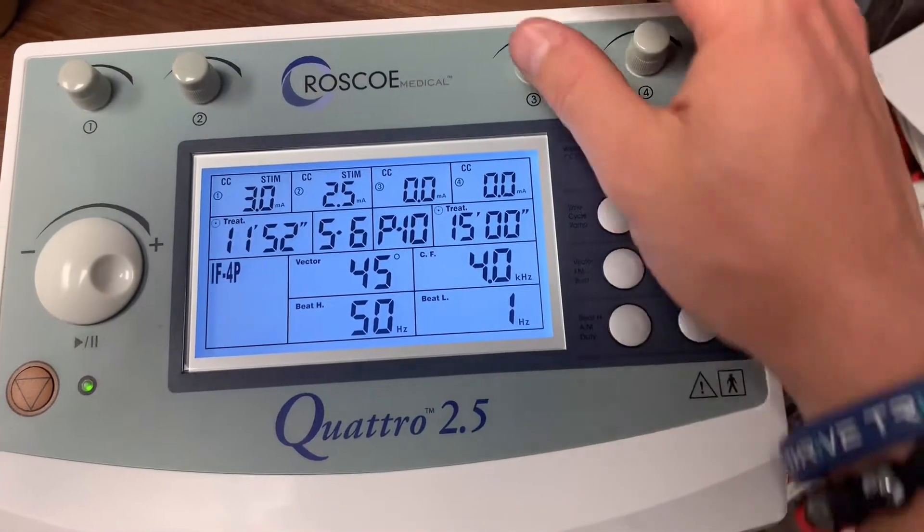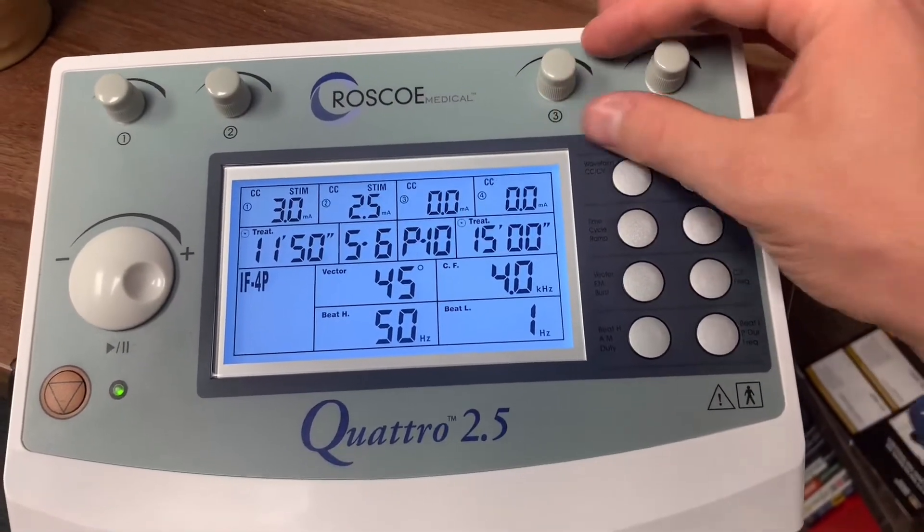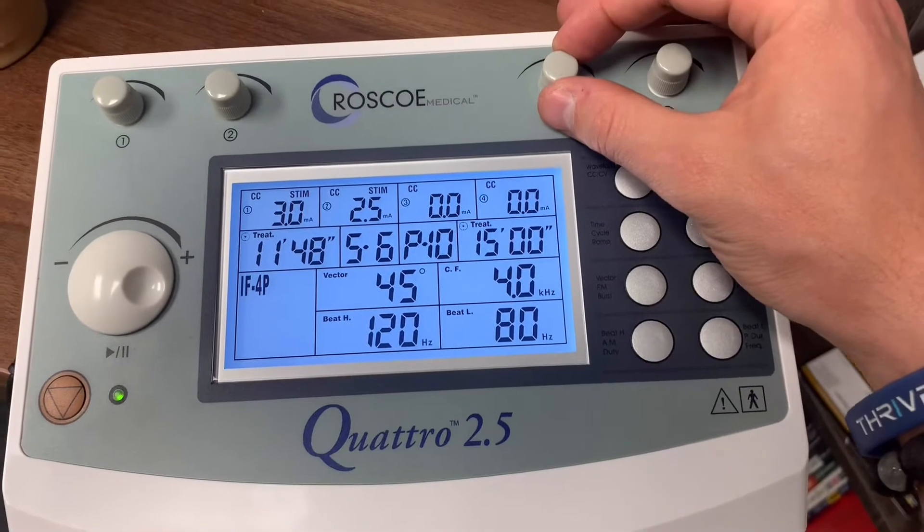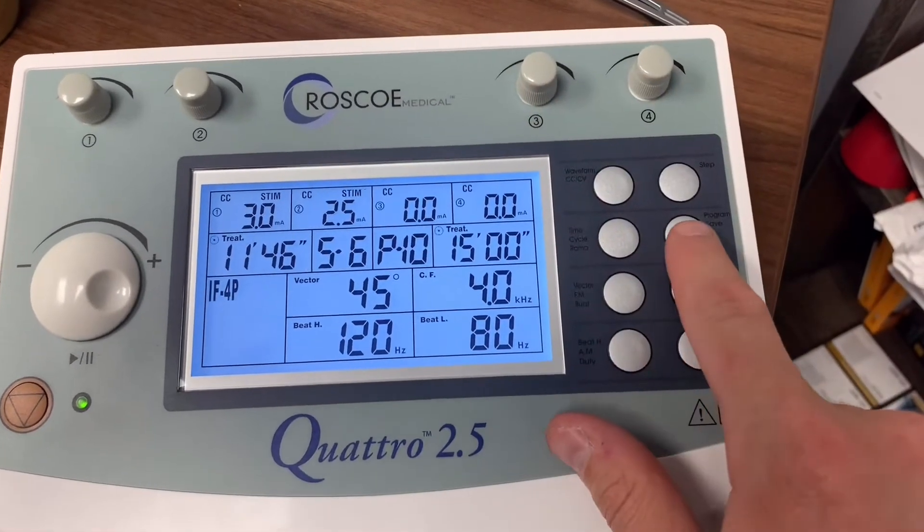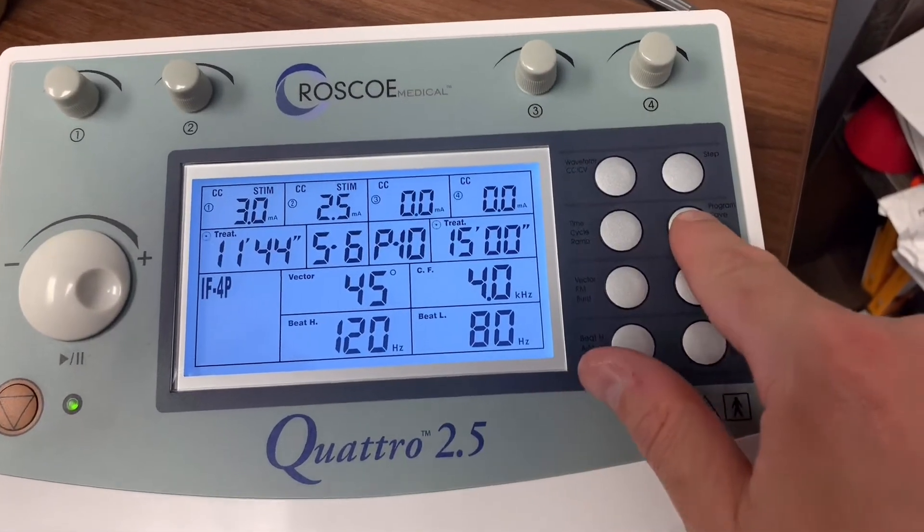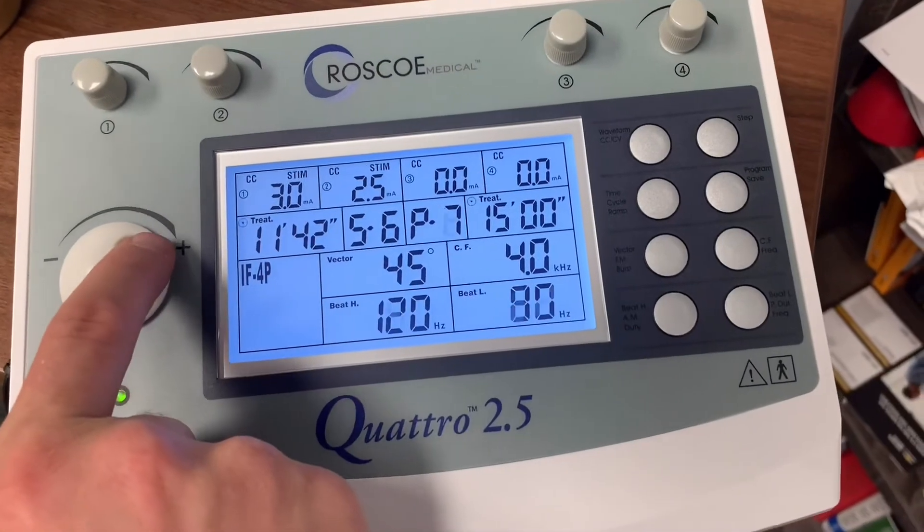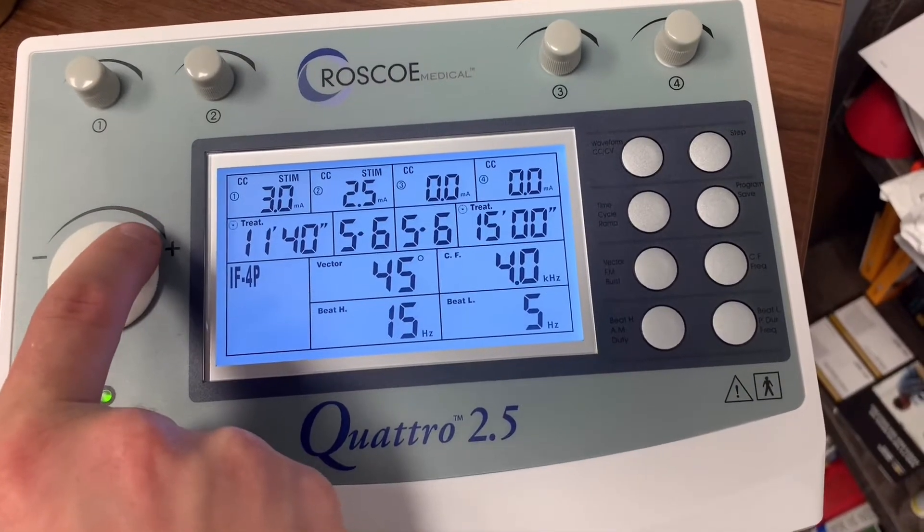Then what we're going to do is grab this knob for 3 and 4, and then we're going to stop it. So now we're going to save this. We're going to hit program, we're going to go to channel 6.